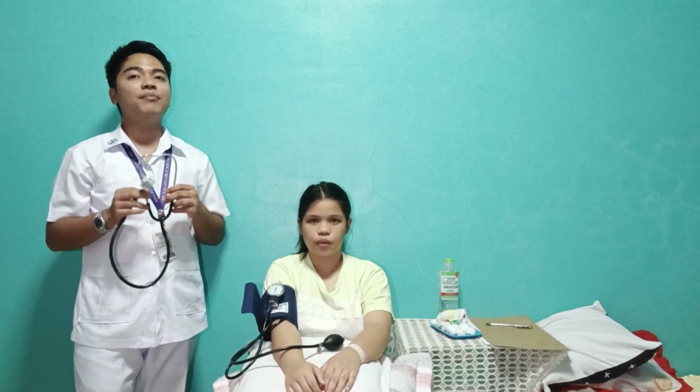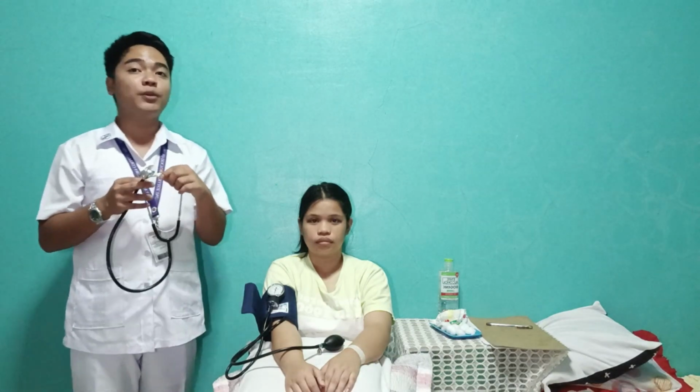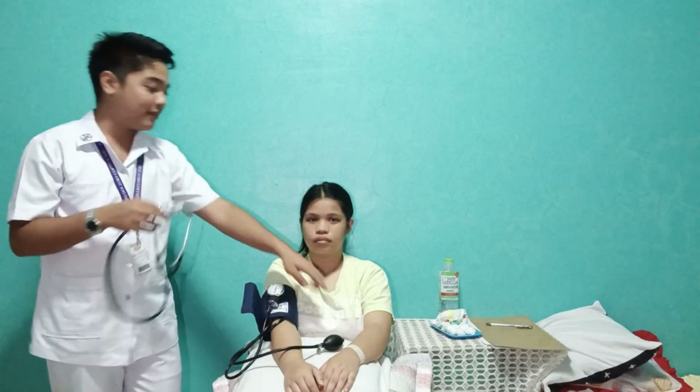Once I have found the brachial artery, I'm going to need to inflate the cuff to 140 millimeters of mercury. So now I'm going to deflate the cuff, and the first sound that I will hear would be her systolic pressure. For the diastolic number, it would be the period of silence after the last sound that I have heard. Since this is my patient's initial examination, I'm going to need to do the procedure again on her other arm.